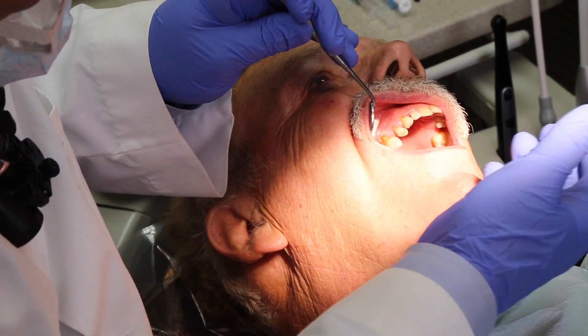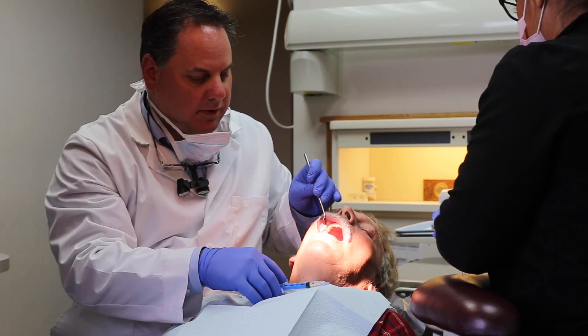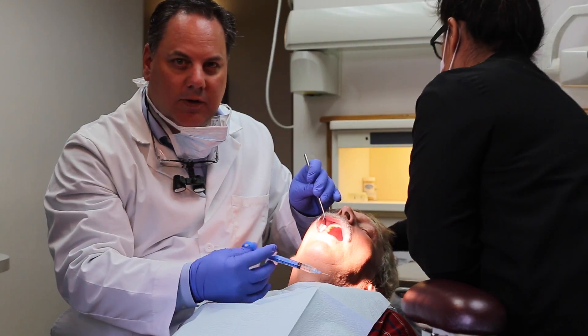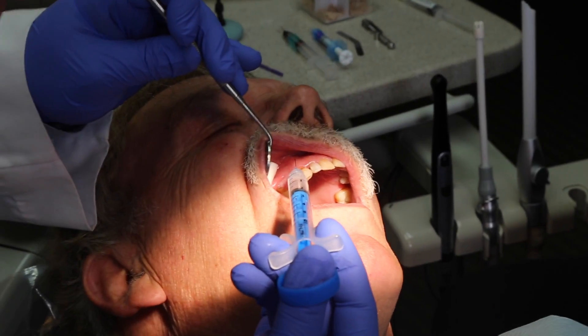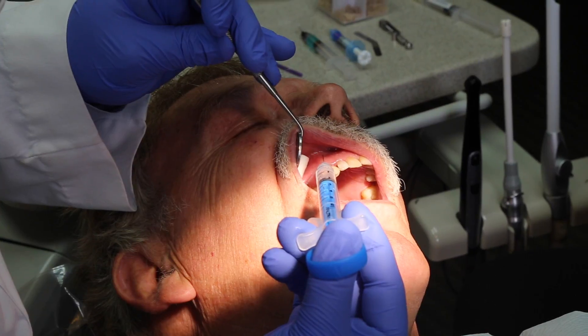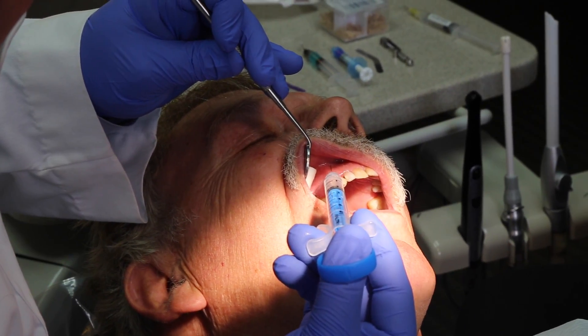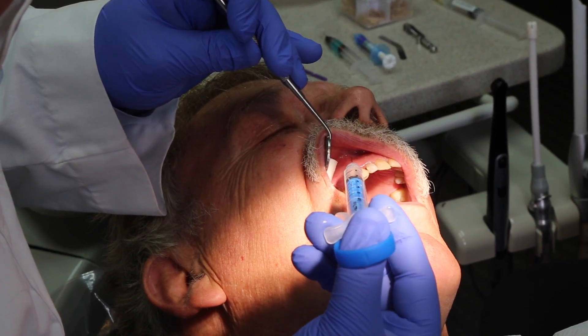One of the special things about the Nutri is that when it's drawn from the system, the solution creates what we call a CO2 microbubble, and we use that as our topical. We'll literally just put a little drop right on the tissue here.